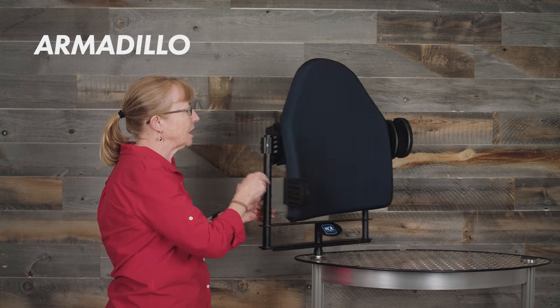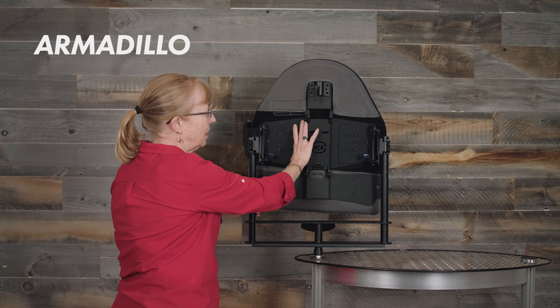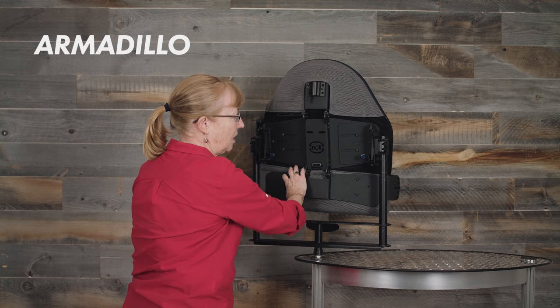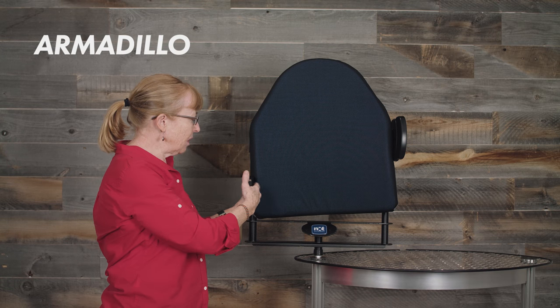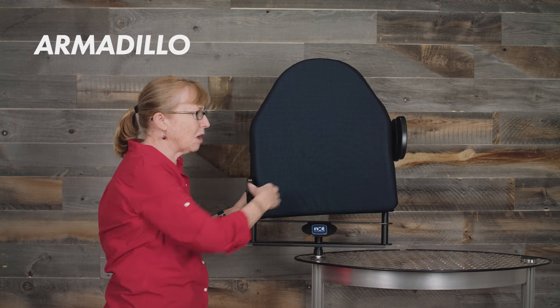We also have external lateral supports for the Armadillo. These help with trunk support or pelvic support, so they can either be attached on the middle area or on the pelvic area. We have a dual pad in the thoracic area and a pelvic pad — this is the small and that's the dual. Both of them you can push in a little more proximally or distally, as well as in and out, so there is a little flexibility for your clients.